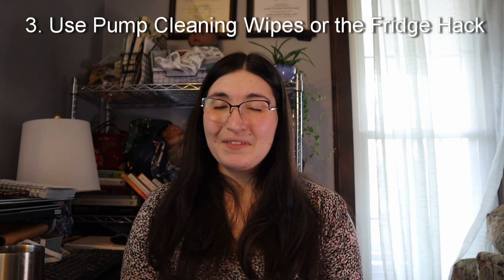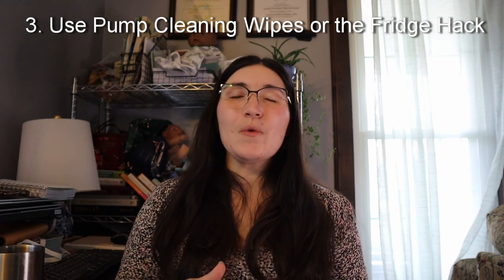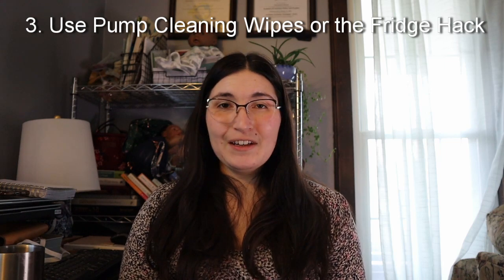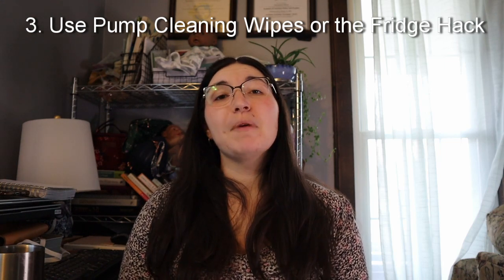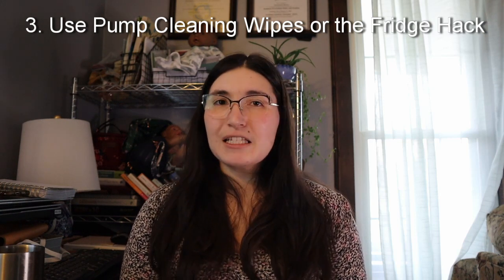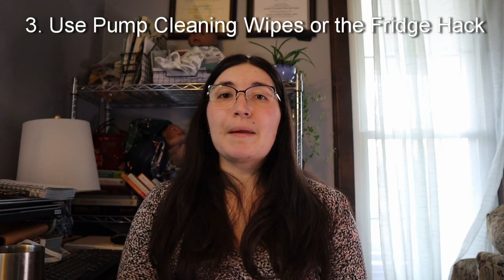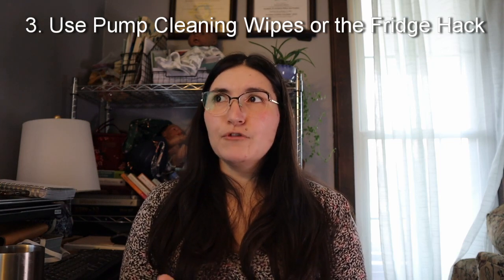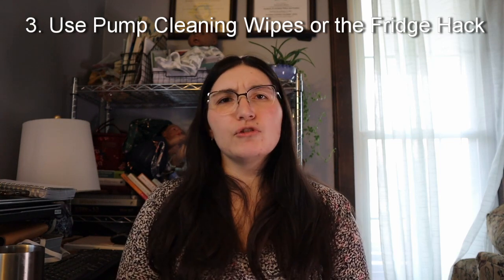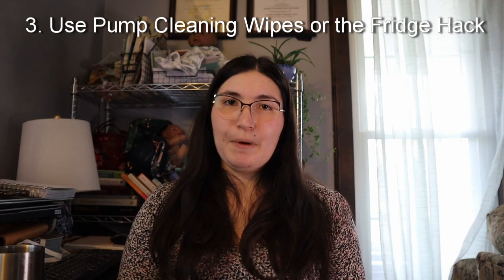Number 3, for cleaning your pump at work, it is so much simpler and very effective to use pump cleaning wipes. You can also get like the bottle pacifier cleaning wipes, the things that are safe for baby to put in their mouth after, I think they're usually baking soda wipes. Those are great to use for cleaning your pump parts.